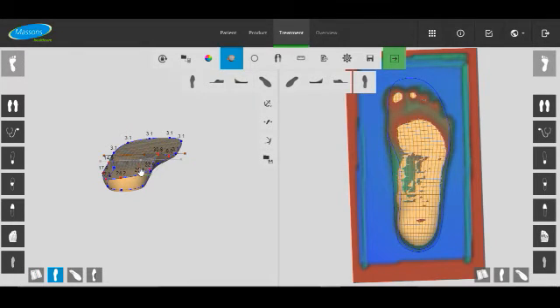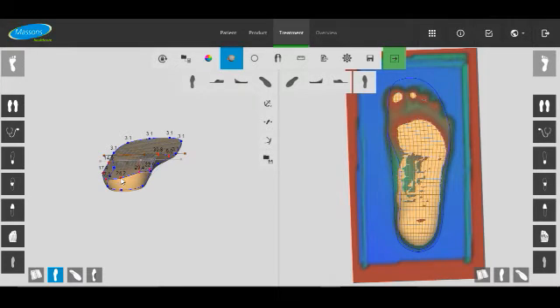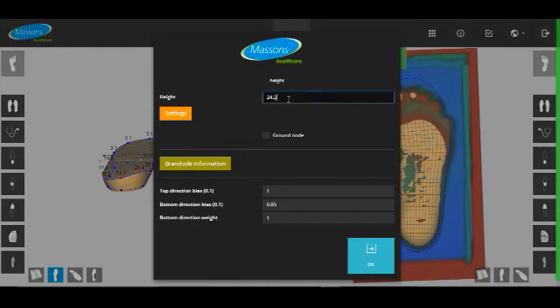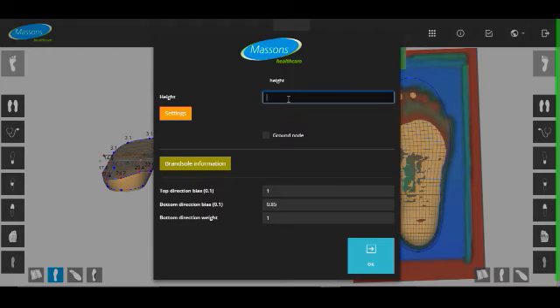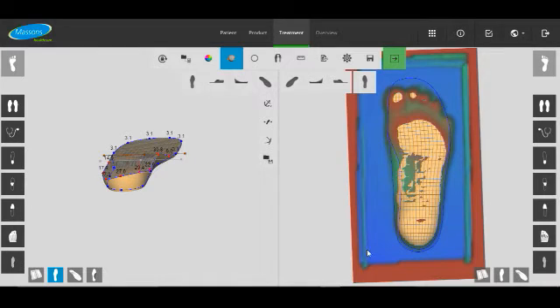So you can either grab the points and drag them up to increase the cup height, or you can right click and just put a measurement straight in there. There we go.